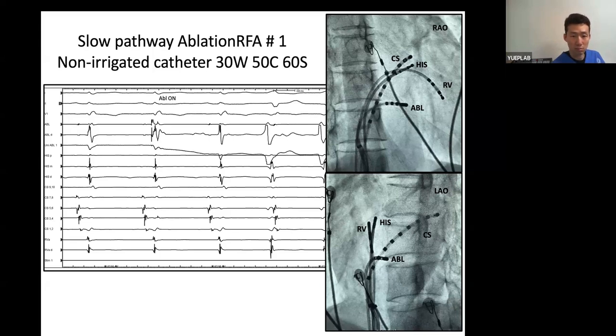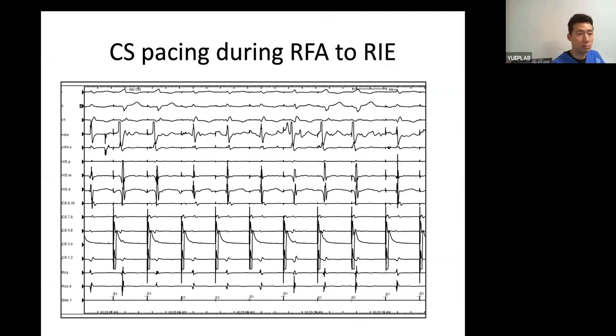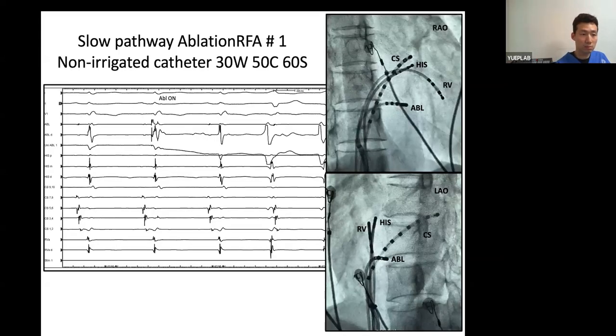Okay? Yeah. So you look at your compare picture. Okay, go to next. So during the RFA, go back to the ablation signal. You had the ablation signal there. This ablation RF on, that's catheter induced, probably by PVC.